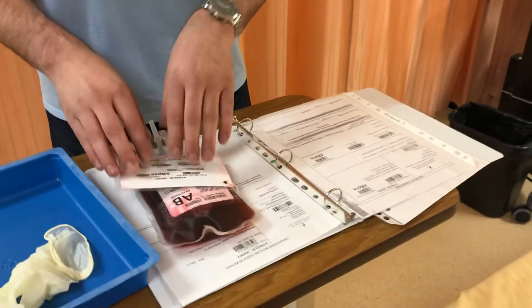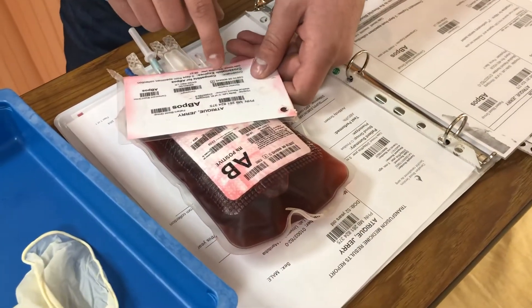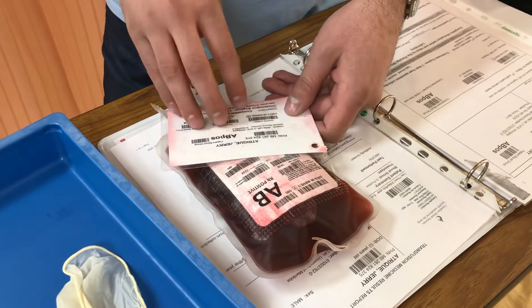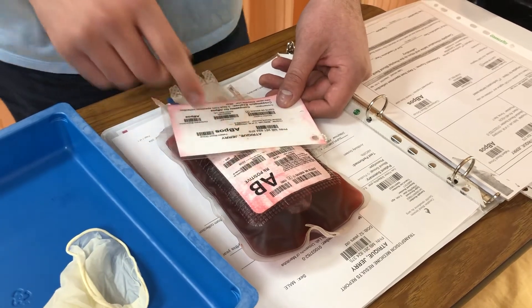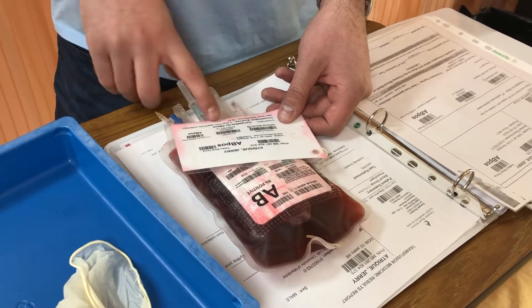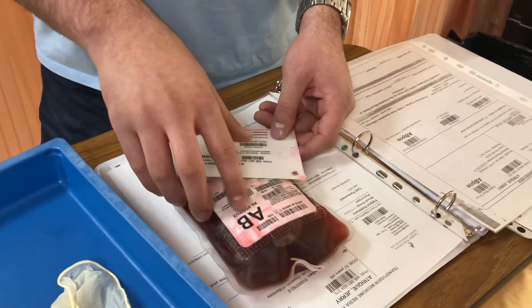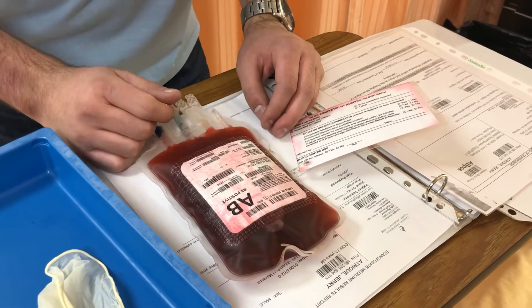Now I'm ready to compare my blood tag to my blood bag. Donation number: C0-510-0808-900-445, boxed Y — matches. The blood bag is AB positive, and the patient's blood group is AB positive, so they're compatible. The crossmatch isn't expired. I'm giving red blood cells, and the bag itself isn't expired either.